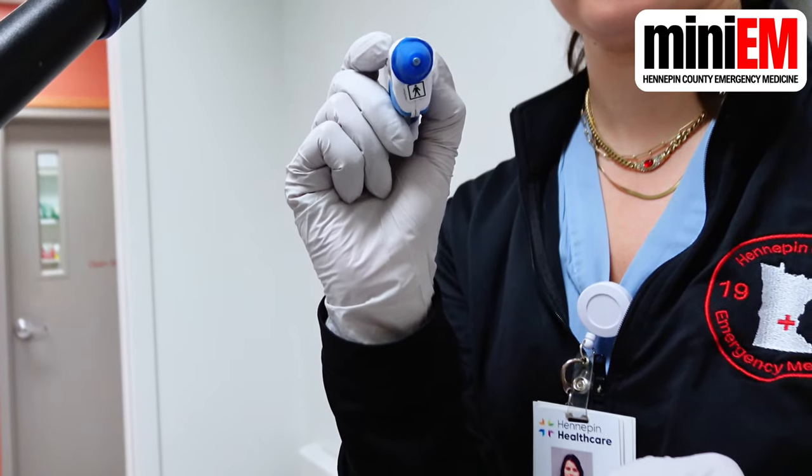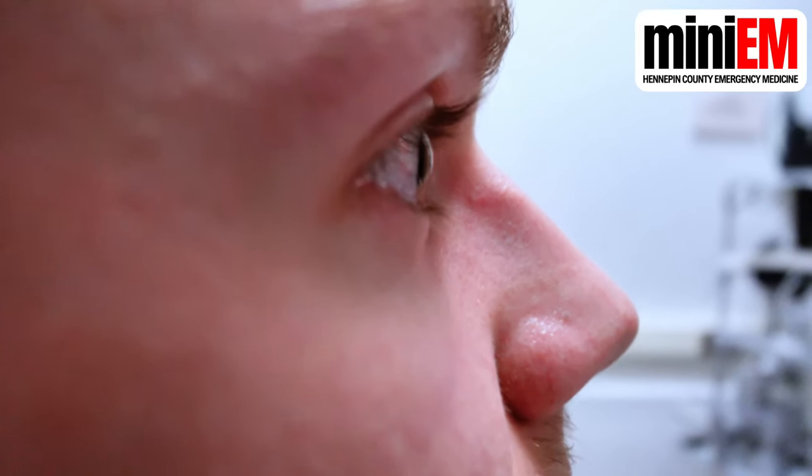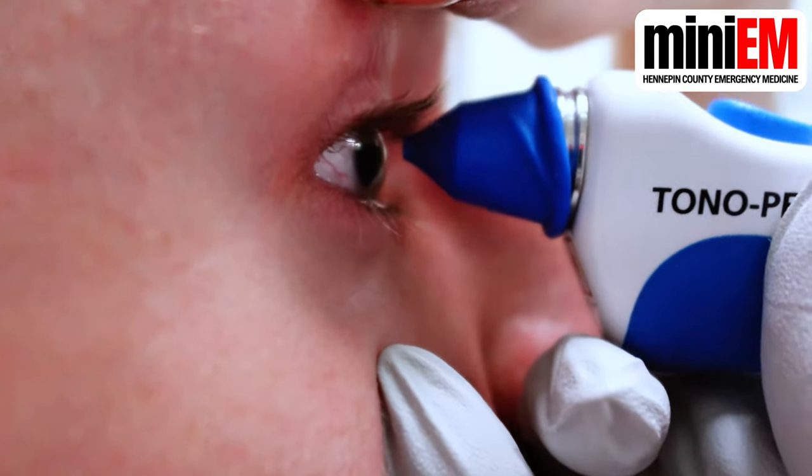You hold the pen just like a pencil. You don't have to hold it perfectly horizontal, which means you can do this on patients while they're supine. Have them fix their gaze on something, then tap gently against the patient's cornea right over the pupil. The tono pen will beep when you take a good measurement. Keep tapping in rapid succession until you hear one long beep, which means it's done measuring.